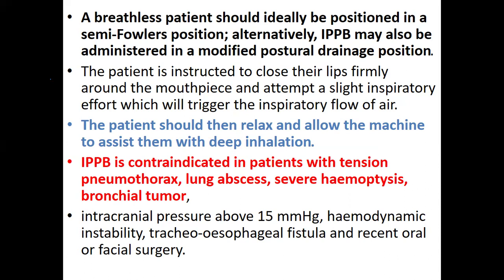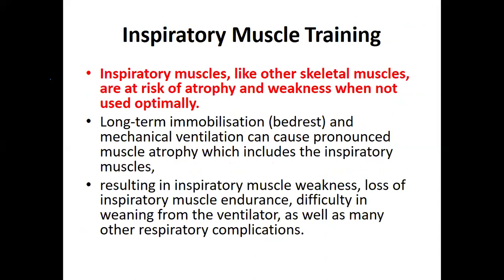Then the patient should relax and allow the machine to assist them to do deep breathing. IPPB is contraindicated in patients with tension pneumothorax, lung abscess, severe hemoptysis, as well as bronchial tumors, among other contraindications.